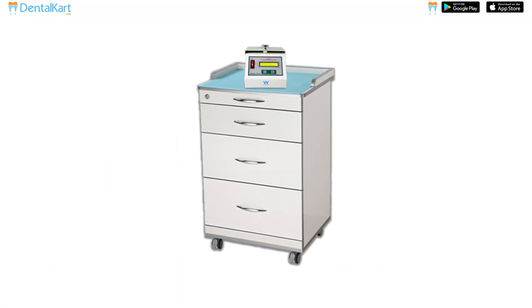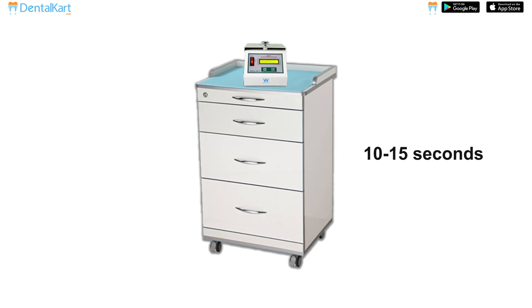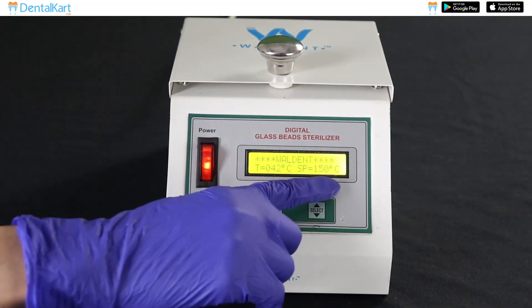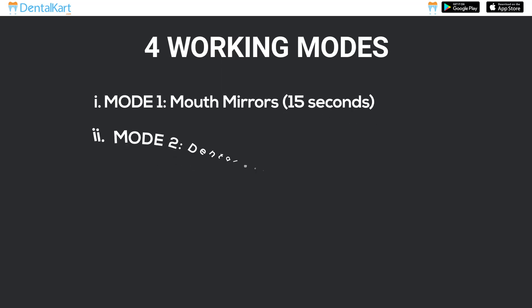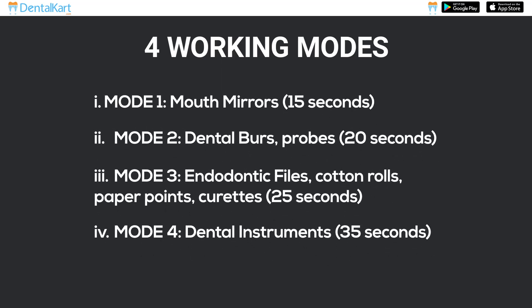Walden Digital Glass Bead Sterilizer is perfect for chair-side sterilization as it only takes 10 to 15 seconds. It is portable in size and consumes less power, has a digital display and gives a ready-to-use signal with a buzzer. It has four working modes based on the time required for different items to get sterilized.